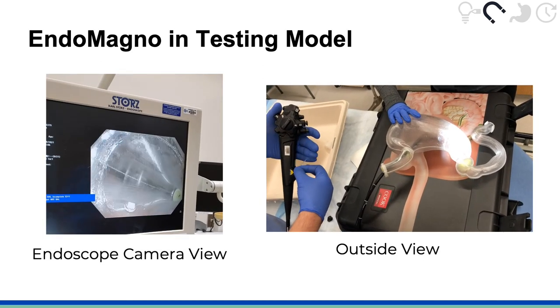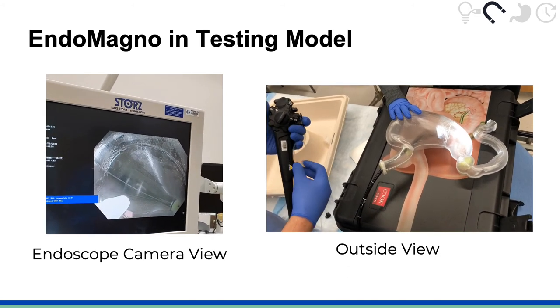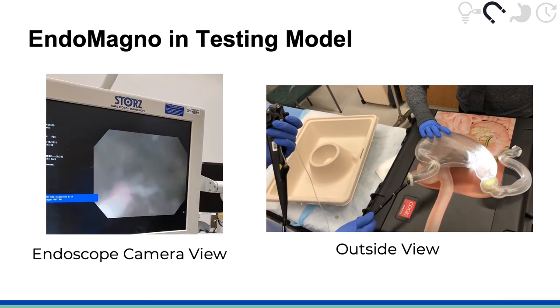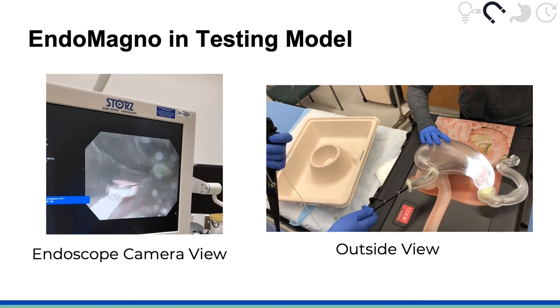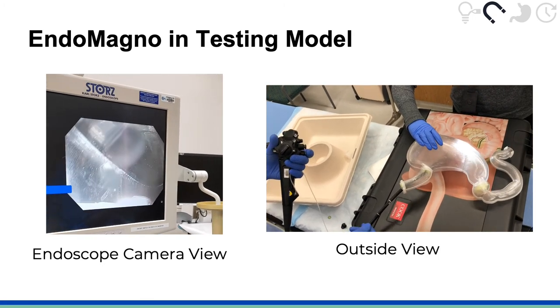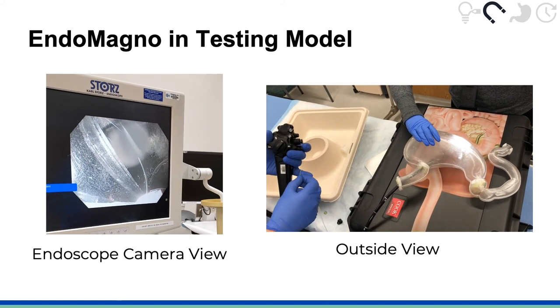In this video demonstration, a button battery labeled with a pink sticker is inside the stomach portion of our 3D printed model. Here we show both the endoscope camera view and the outside view of the procedure. The Endomagno is extended out from the instrument channel and we can see that the button battery jumps right to the magnetic probe at the tip.